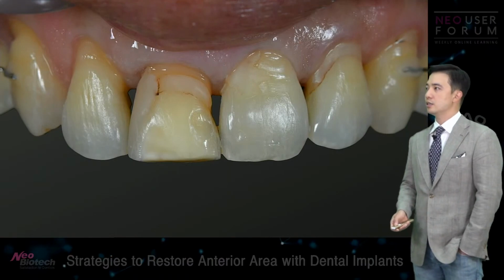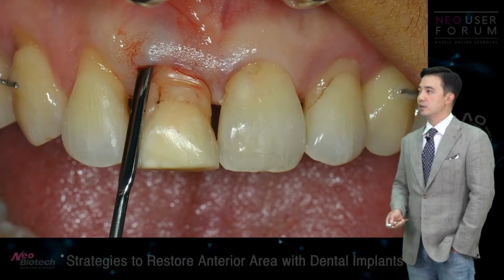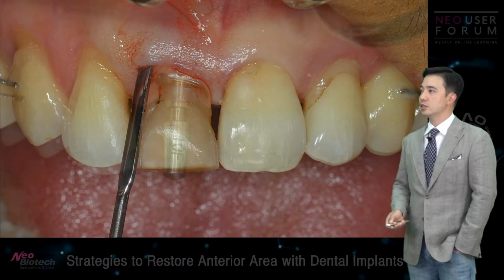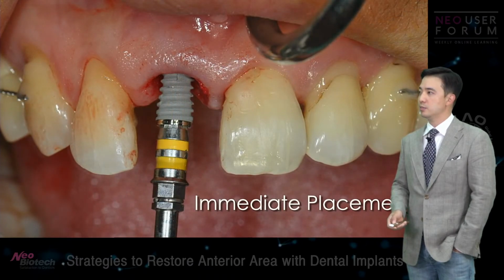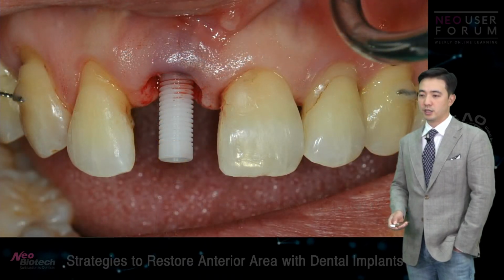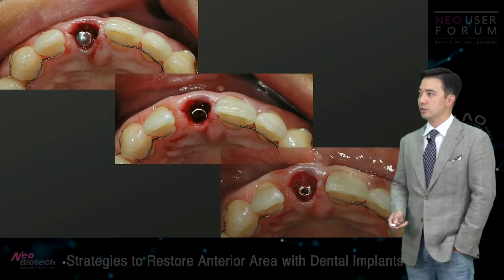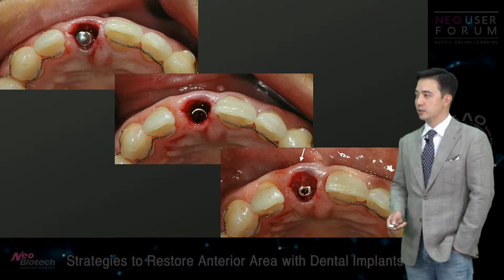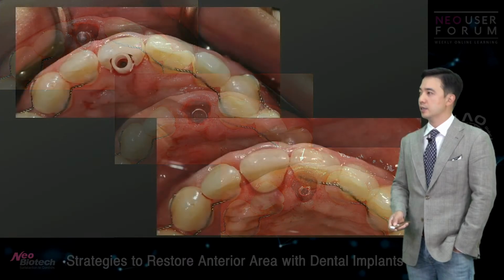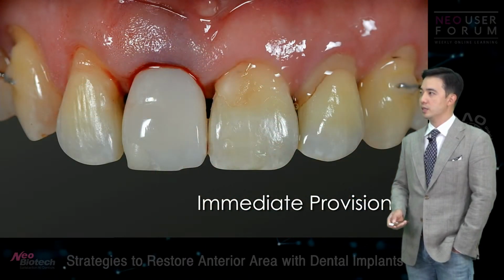So this is on the day of implant placement, extracted in a minimally invasive fashion using periotome, immediate implant placement. For this case, we also did immediate provisional restorations because we had such good initial stability. So I added a little bone right there and fabricated the immediate provisional.